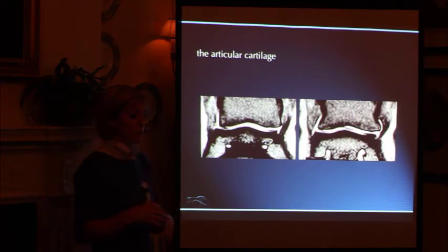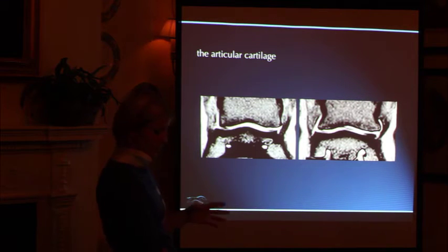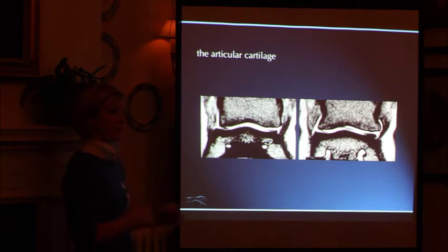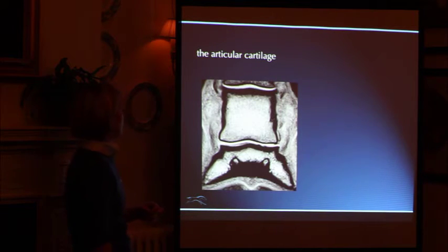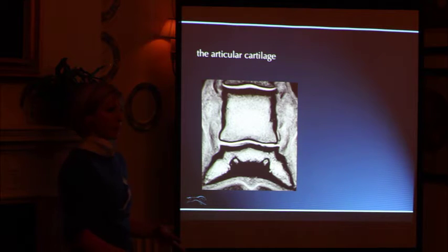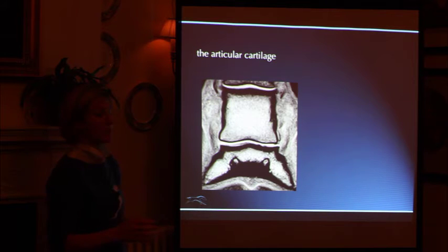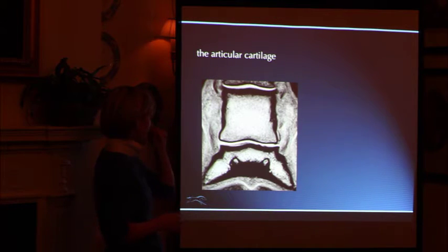When we see it in combination, particularly with joint remodelling, so osteophytosis of the margins of the joint or subchondral changes, then we can be pretty certain that it's there. And it's only with those very thin slices that you can find this. That's why you've got to strive to get the horse to stand still and to get the nice images. So it's a little bit controversial, cartilage imaging. For anybody that knows anything about MRI, it's very controversial and a hot topic, even in people using very high field magnets like 7 Tesla magnets, because it's difficult, and it's quite difficult on our system.